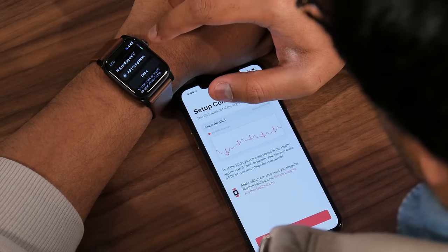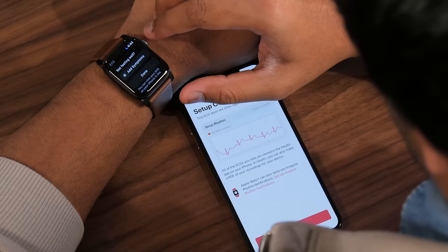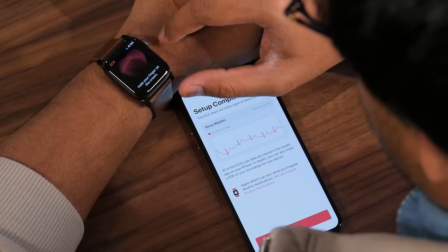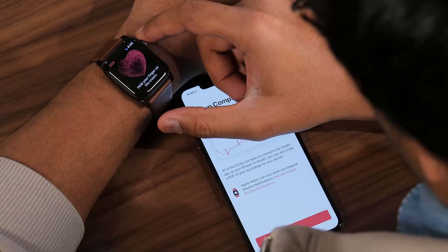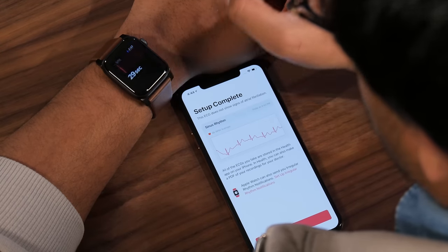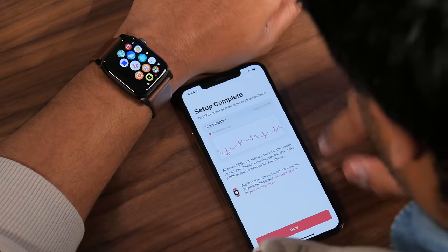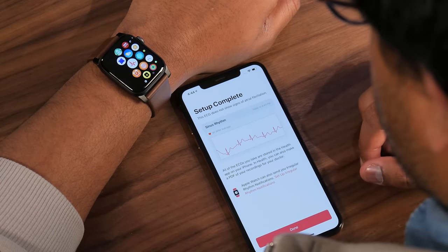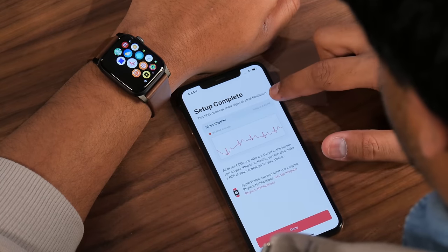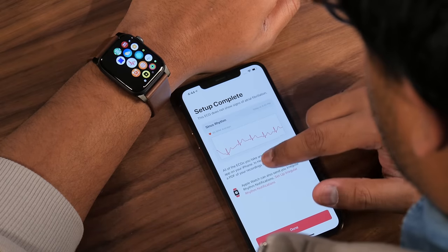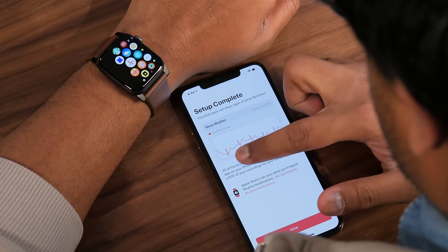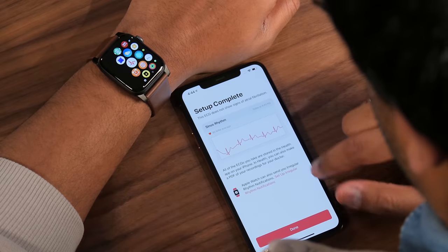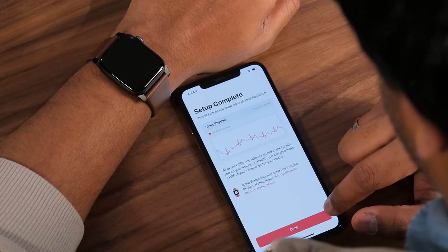There's a feature that lets you add symptoms so you can include that in a report for your doctor. Press Done, and you can check your ECG as many times as you want. Back on the app, it says setup complete and shows the result — in our case, sinus rhythm with no signs of atrial fibrillation. All of the ECGs you take are stored in the Health app on your iPhone, where you can also make a PDF of your recordings for your doctor.